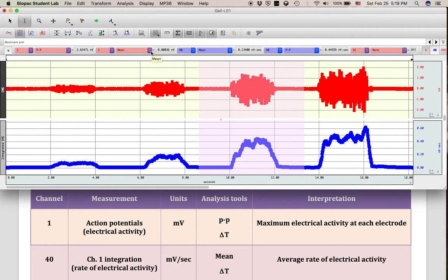Notice that the mean of channel 1 is just about 0, and that's because these values in the positive and negative direction are canceling each other out. You can refer to another video I have in this playlist if you want further explanation of why we have positive and negative values here.